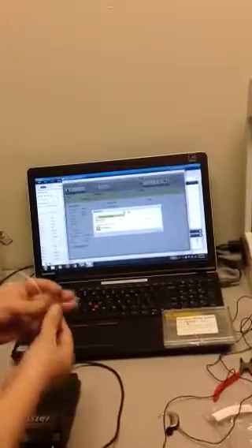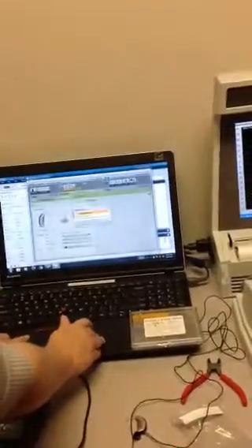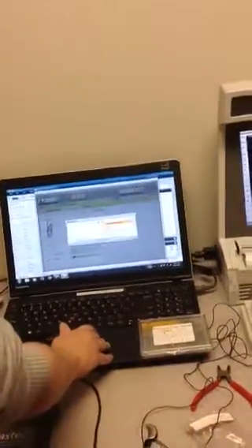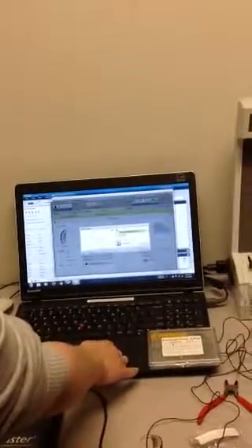And so I need to switch ears because we're going to fit her to a left ear because that's what her mold is for. Gotta reconnect. Everyone's videotaping now. Yes. I know, I was looking forward to that because the first group, none of the Phonak computers were working when they were here. So we did a modified version of this.